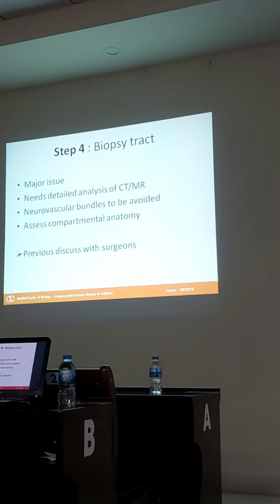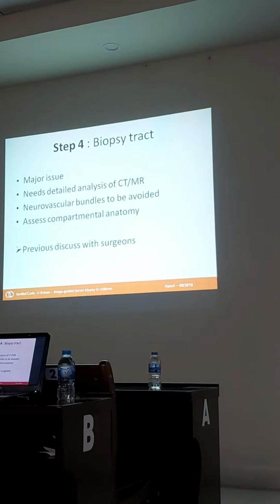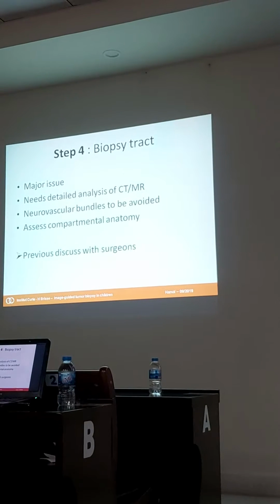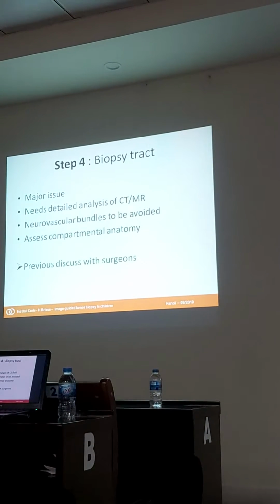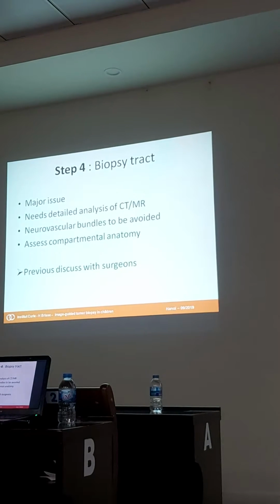Before doing this, you must keep in mind that you have to choose the appropriate needle tract. When you perform a biopsy, you should always discuss with the surgeon who will further operate on the child the way you go with the needle.